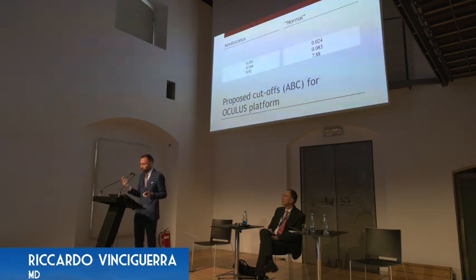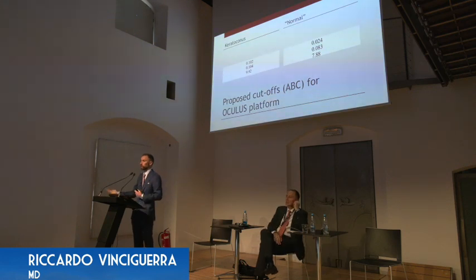Why? But regardless of that, they were saying, well, if you have an early keratoconus, then you want to use the noise level of normal patients. If you have a keratoconus, then you use the keratoconus noise level. To me, this inevitably doesn't make any sense. You should have a noise level for early, moderate, and advanced keratoconus.